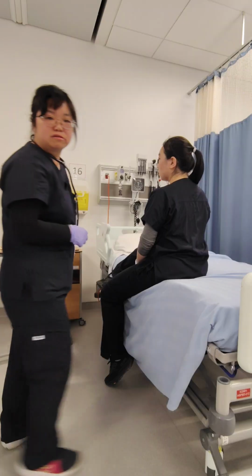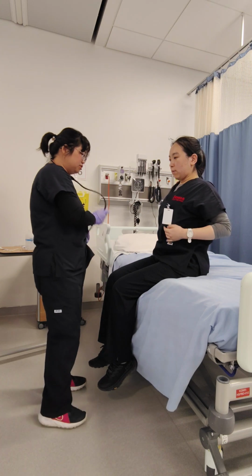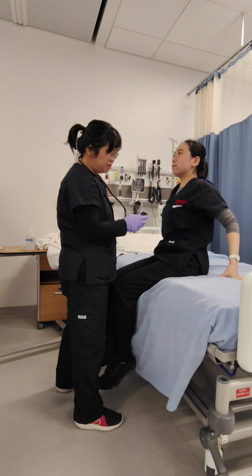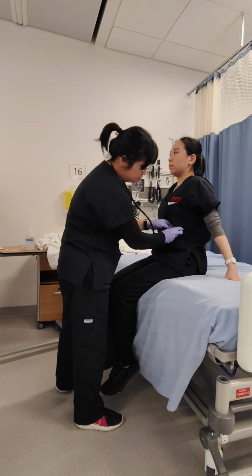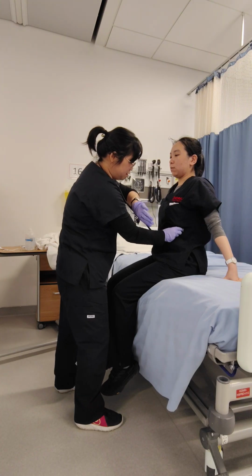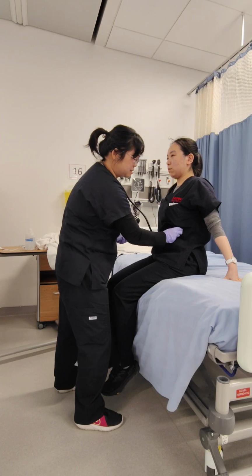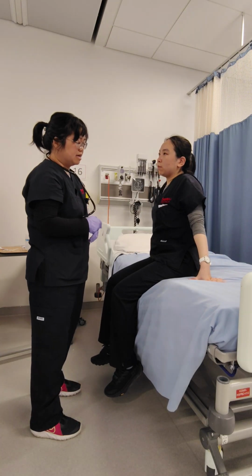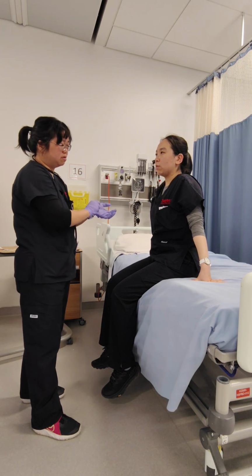Okay, next I move to the apical heart rate. So I auscultate the apical heart rate at the mitral valve area, at the fifth intercostal space and the left midclavicular line, and it's here. So I count with my watch for 30 seconds and multiply by 2. Its rate is 72 beats per minute, and it's regular rhythm, and I can hear S1 lub, S2 dub sounds, and no S3, S4 sounds, no murmurs.